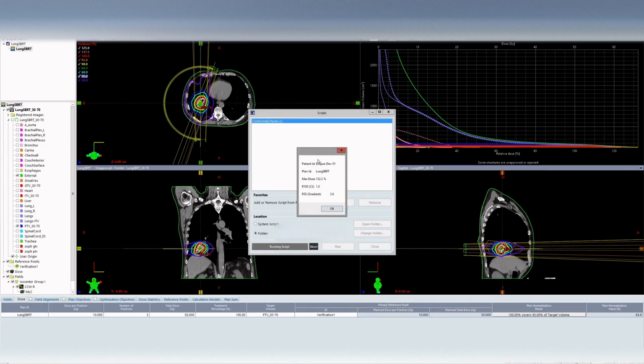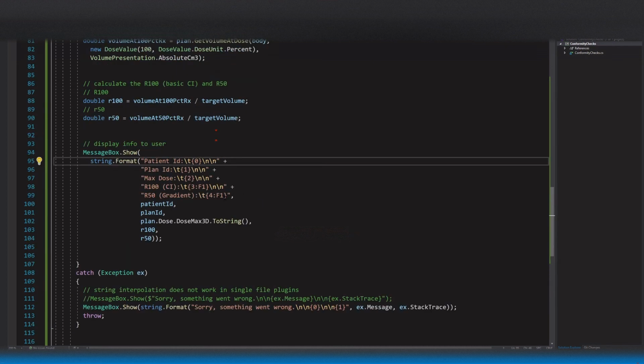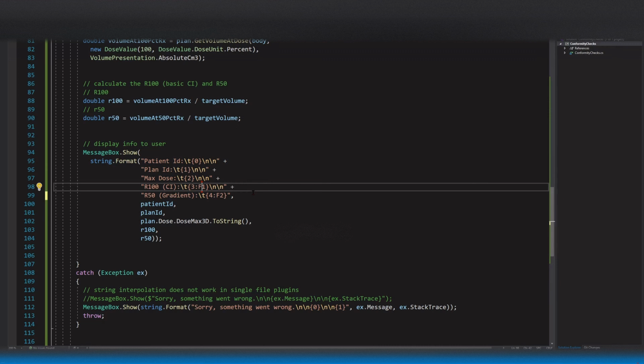All right, so we've got patient ID, plan ID, which is kind of redundant because obviously that's what's pulled in, but for a sanity check, I guess. Okay, so max dose, we have our R100, which is 1.0, and then we have our R50 gradient. So let's add another tab after this one so we can get these two right here, okay? And actually for the R50, we should probably do more decimal places, probably 2, right? So let's change this to F2, and then that will do that.